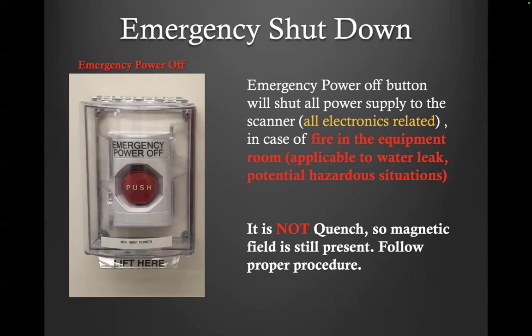But that's for emergency. And you can very well also just turn off the MRI, and it takes about 15-20 minutes. So that's also possible. You don't always have to do emergency power off.